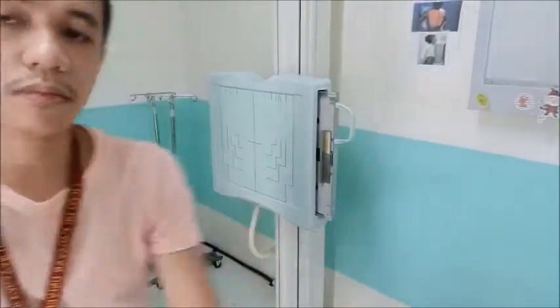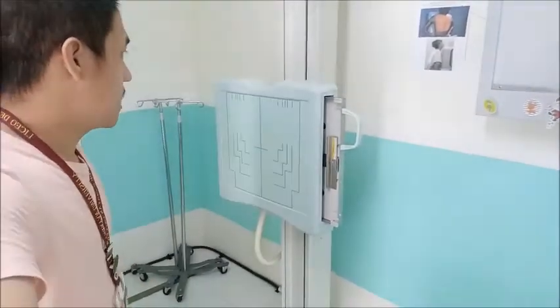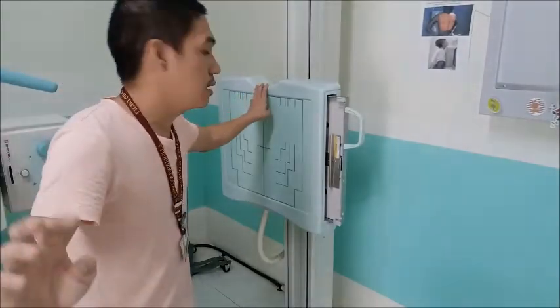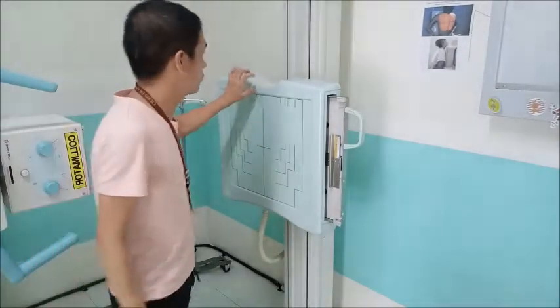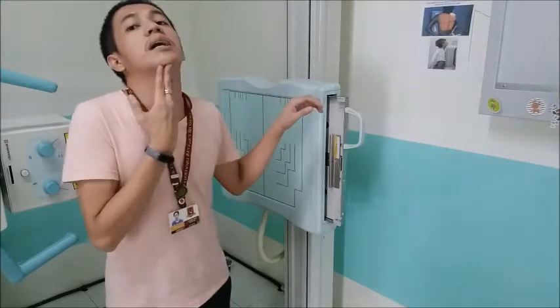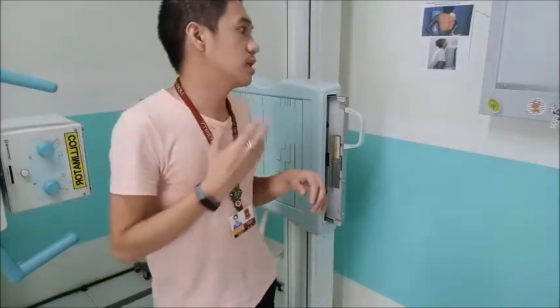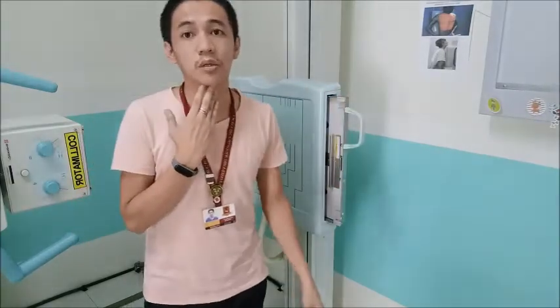Sometimes they can stand, but the problem is they cannot do the PA projection because their chin will be raised and it will be uncomfortable for them. Sometimes they turn their backs.